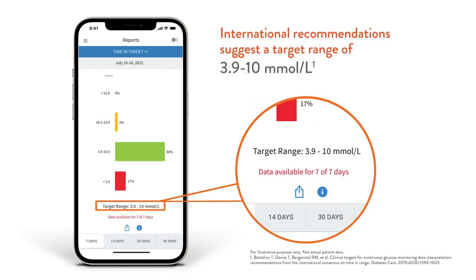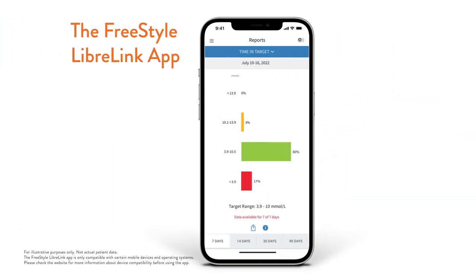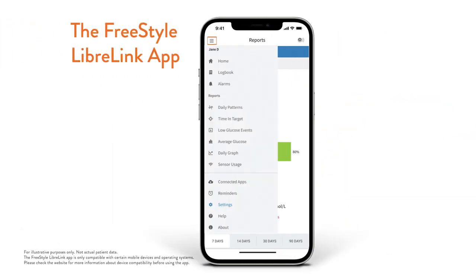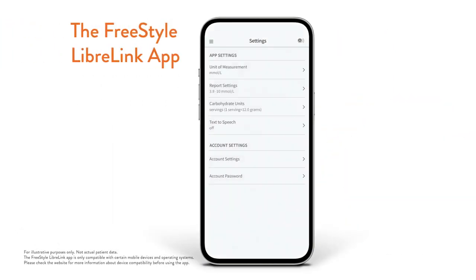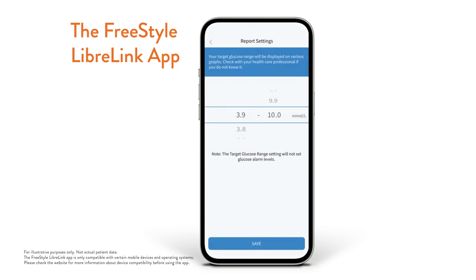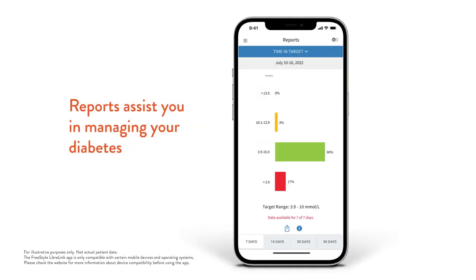You can check your target settings by going to Menu, Settings, Report Settings. Freestyle Libre 2 reports quickly give you the answers you are looking for.